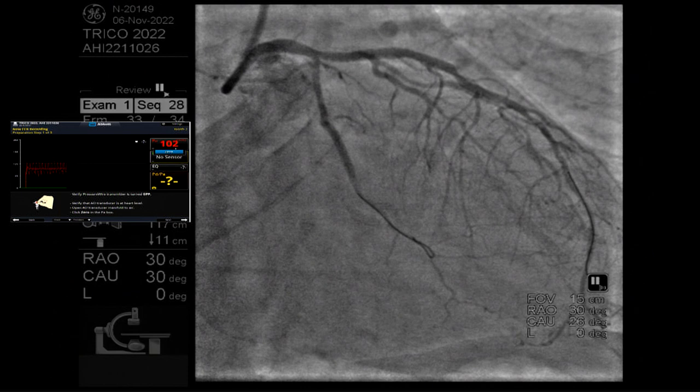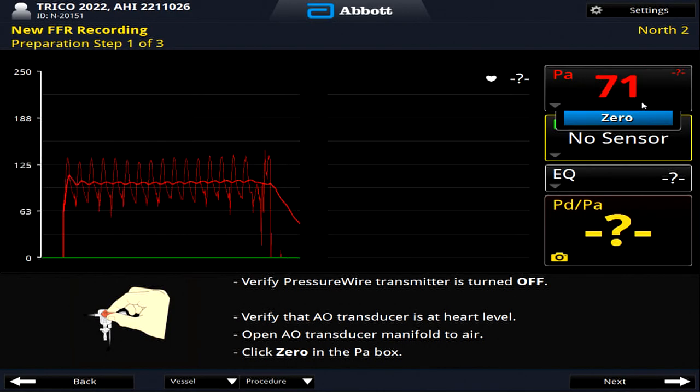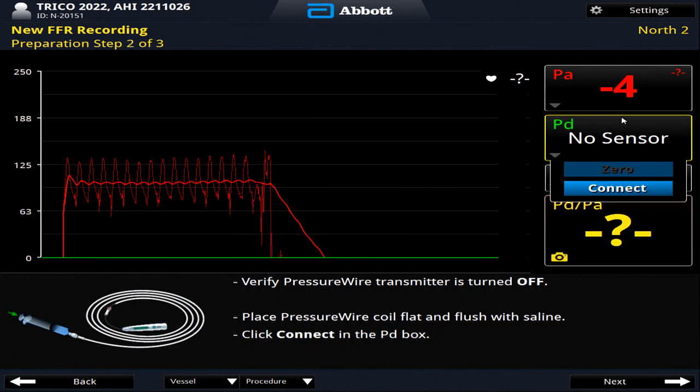We've got some disease at the very distal end of the stent here. It's also sort of some fibrotic and some lipidic plaque. And so rather than take the risk of that, if I'm going to extend my stent 2 millimeters distally and just cross over into the left main and optimize the whole thing with a giant MSA, I wouldn't be all that worried about doing that.